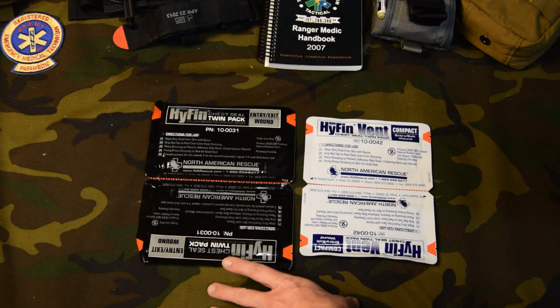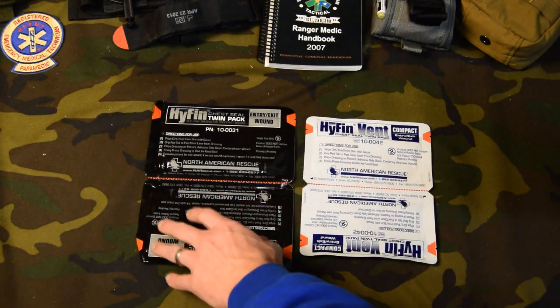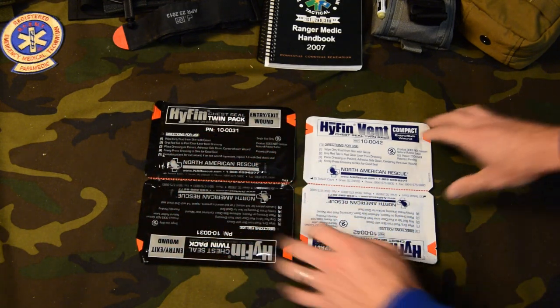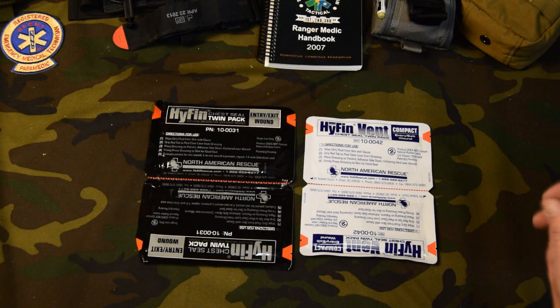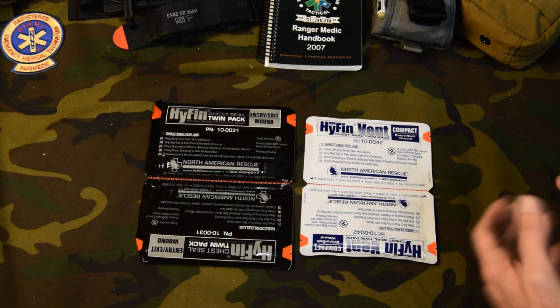Now, this is strictly a size comparison here. This is the non-vented. This is the vented. They make a vented chest seal that's the exact same size as this — dual pack. So this is all I want to do really is compare sizes here. You can see it's a little bit smaller. Takes up a little less real estate in your IFAK, your trauma kit, but it's still going to cover the bases because we're covering penetrating trauma here.